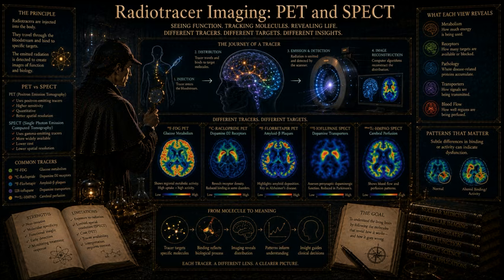If a photon is emitted from the brain and happens to be traveling perfectly parallel to those tiny channels, it flies straight down the straw and strikes the detector. The scanner then knows the photon must have originated somewhere along that single straight path. But what if the photon is traveling at a slight angle? If it is emitted at even a fraction of a degree off-axis, it enters the channel, immediately hits the interior lead wall, and is absorbed. It never reaches the detector.